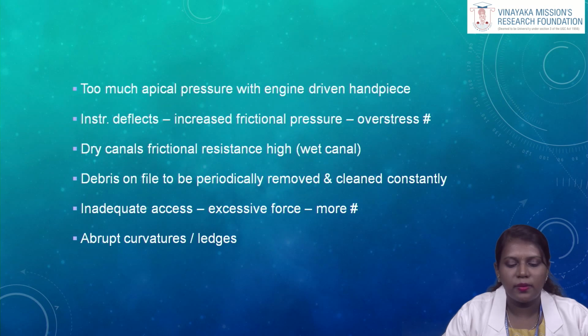Debris on the file has to be removed and cleaned constantly. Inadequate access and excess forces lead to more fracture. Abrupt curvature and ledges also lead to fracture.